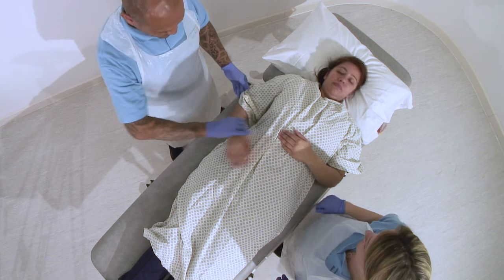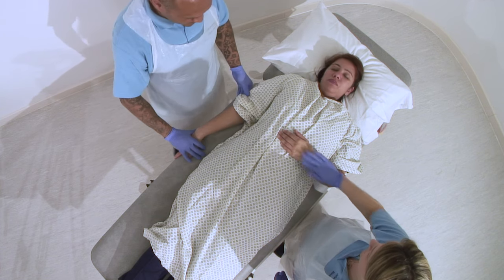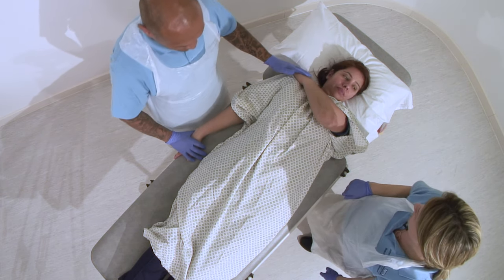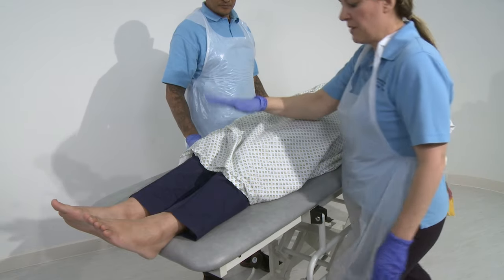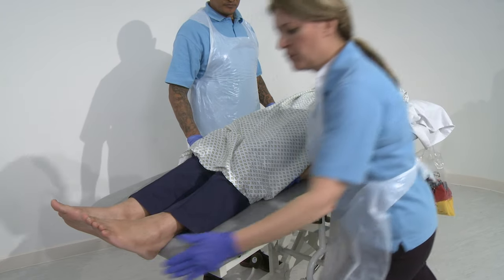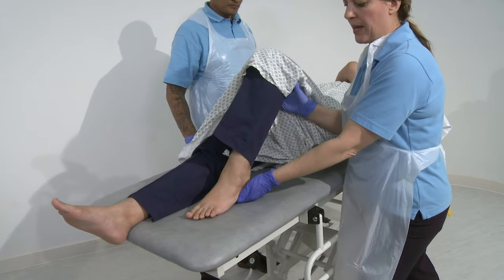Can you just give your hand to Rob? That's it, and take hold of the edge of the bed, and can you put this hand up onto that shoulder for me? Now I'm going to help you with your feet. So what I need to do is come in flat hand in underneath the back of the knee, lunge forward, take hold of the heel and transfer my weight back.